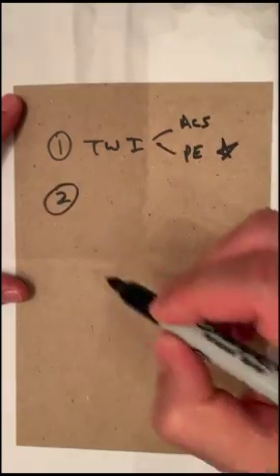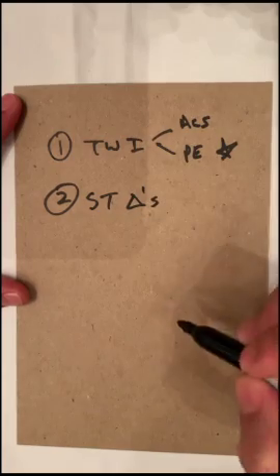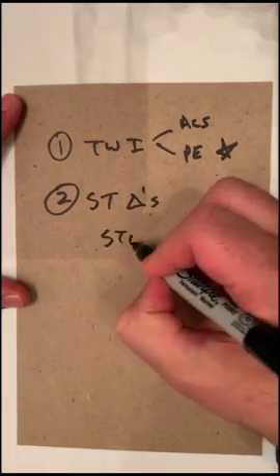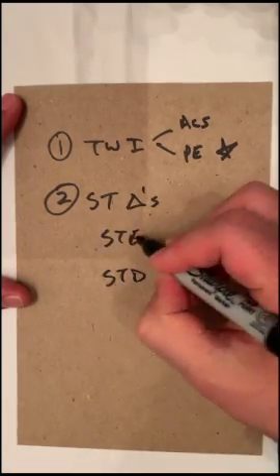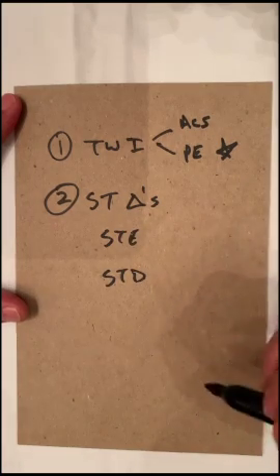The other thing that I never learned in residency was that you can get ST segment changes when you're looking at a PE. You can get ST segment elevation and ST segment depression. ST depression is kind of non-specific, but ST elevation is not uncommon in the presence of PE.